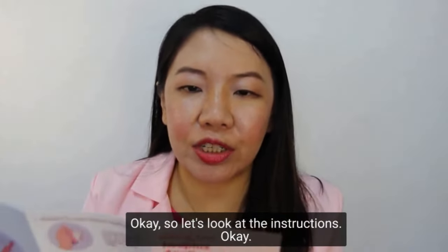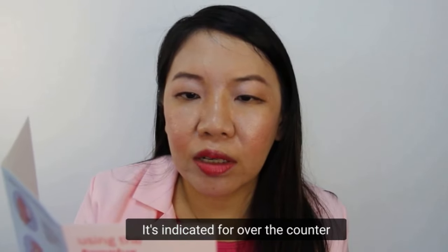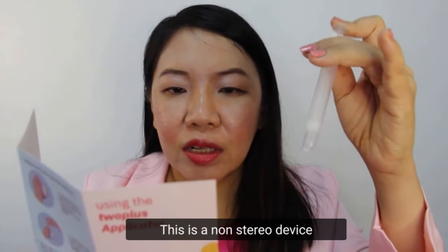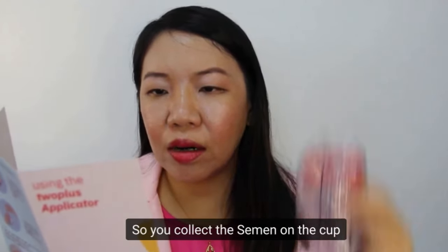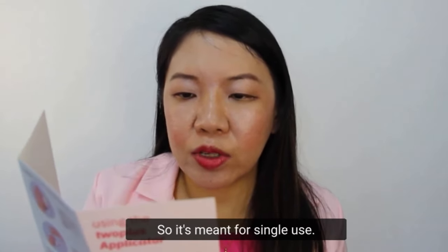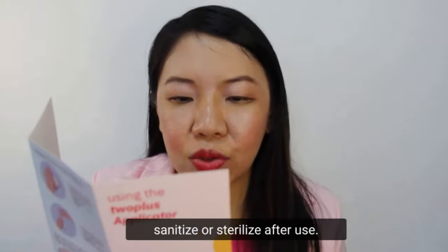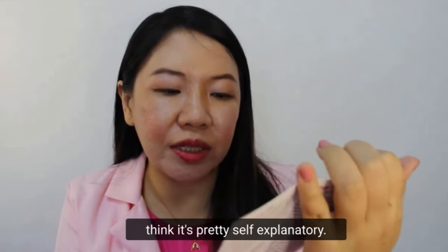It doesn't really bend. Let's look at the instructions. It's indicated for over-the-counter home use for couples who are trying to conceive without sexual intercourse. This is a non-sterile device consisting of a collection cup and applicator. You collect the semen in the cup and then use the applicator to transfer the semen to the proximity of the cervix. It's meant for single use — please do not attempt to sanitize or sterilize after use. Keep at room temperature.